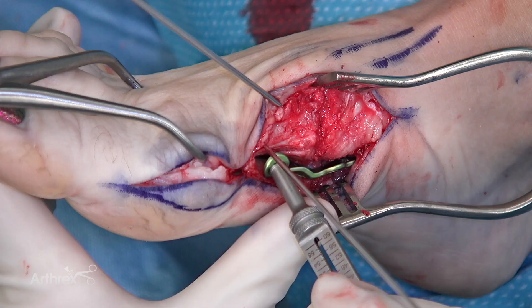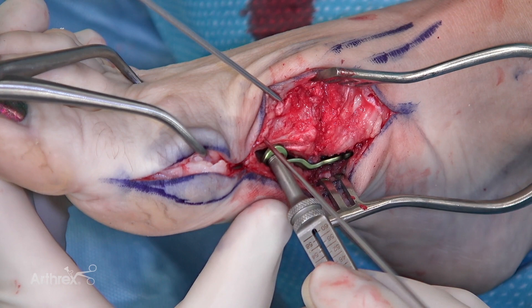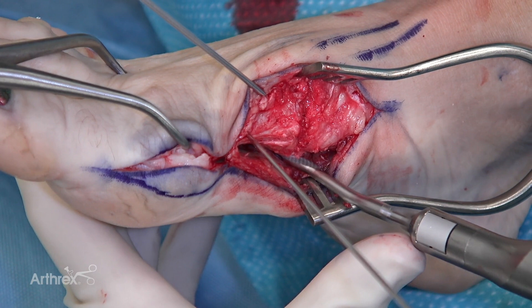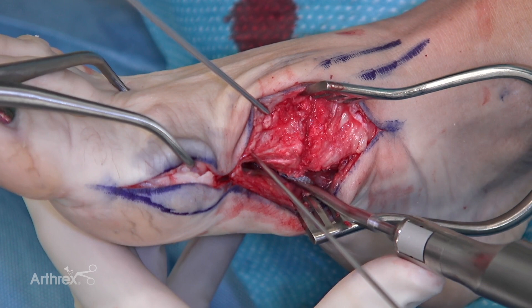IM angle and sesamoids look good. K-wire — yep, we're in good shape. So we're going to first look at how our plate is positioned — and it looks good. I can tell that there is a little bit of a prominence on the plantar side of this joint, so we're going to rasp that down a little bit. I just use this rasp to flatten out the plantar surface — I have to do this maybe ten percent of the time.